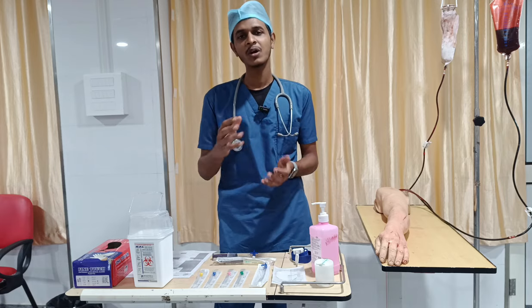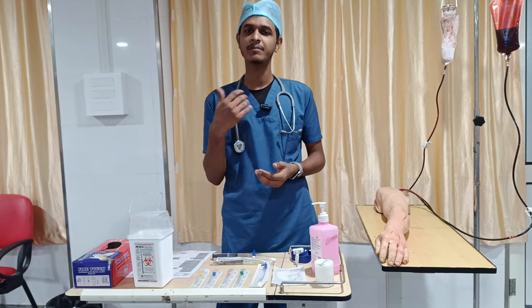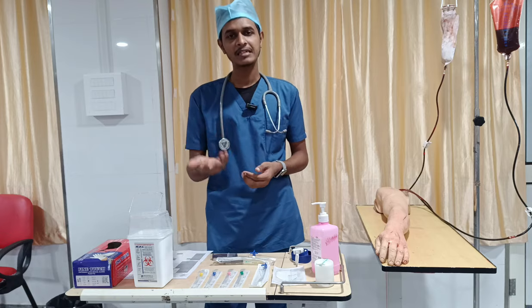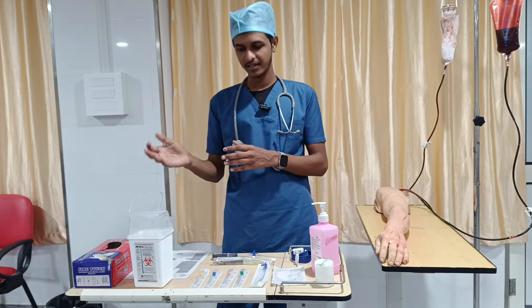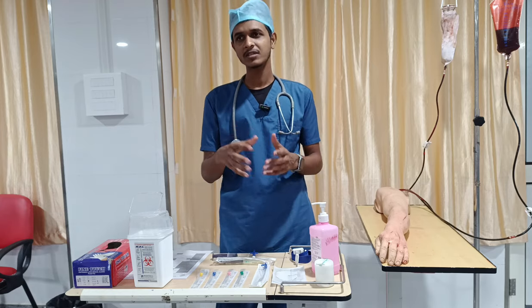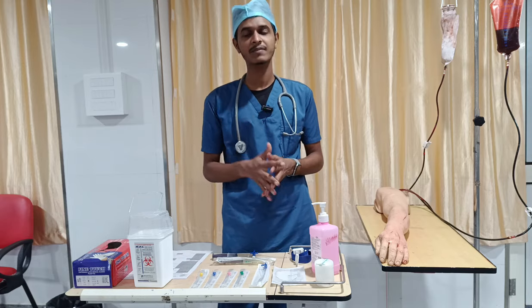Second, we have to verify the person, by seeing the identification number and by asking questions like name, age and sex. Third, you can ask your aide to prepare everything you need for the peripheral IV cannulation. Fourth, we have to take the informed consent. That is one of the important things.